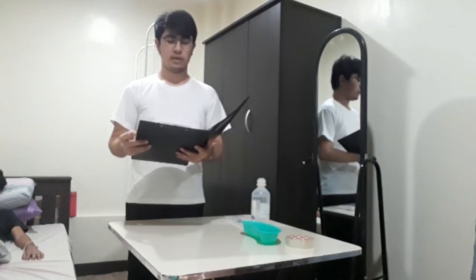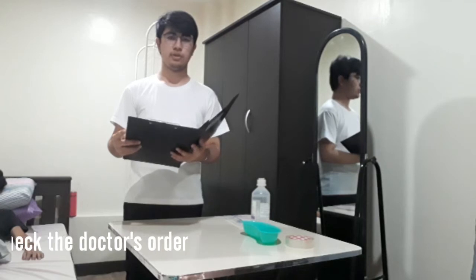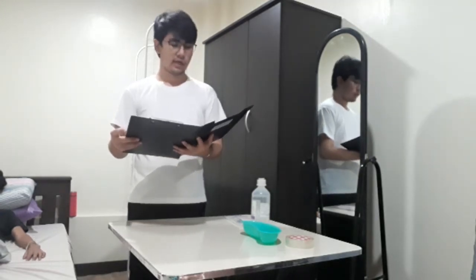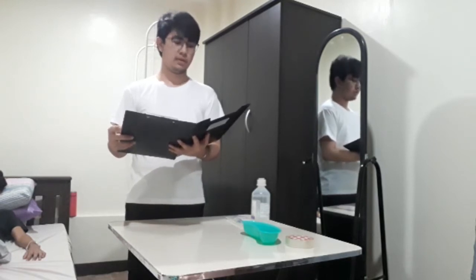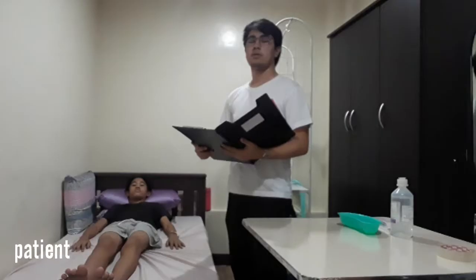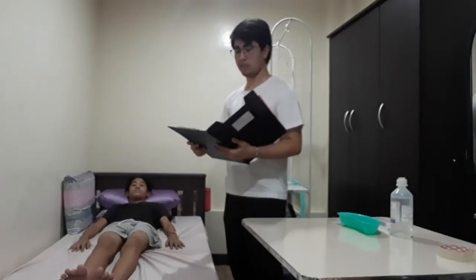Priming IV tubing and regulating flow rate. The first thing we'll do is check the chart for the doctor's order. So, stated here in the doctor's order sheet, Dr. Arla Herrera wants to start an IV therapy with PNSS 1 liter at 20 drops per minute, which will start at 9 a.m. on the date of April 28, 2021.